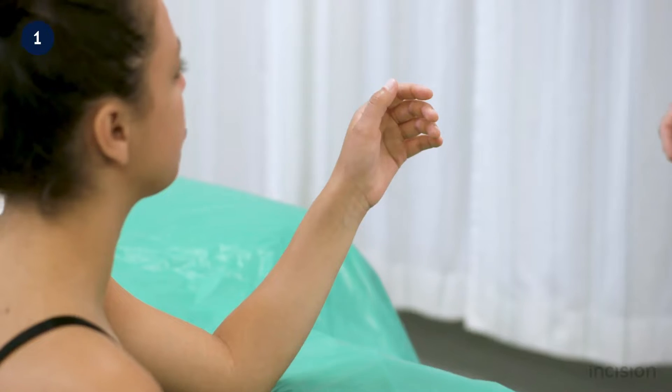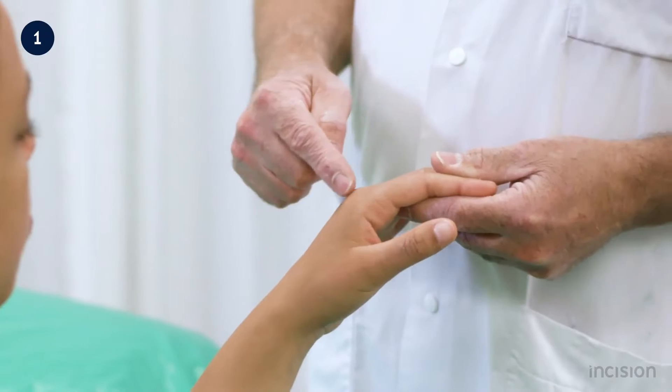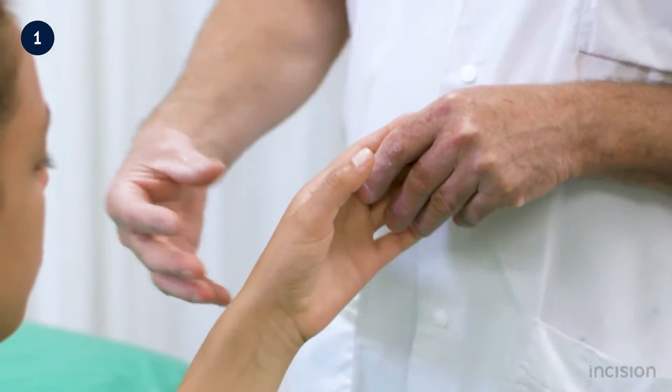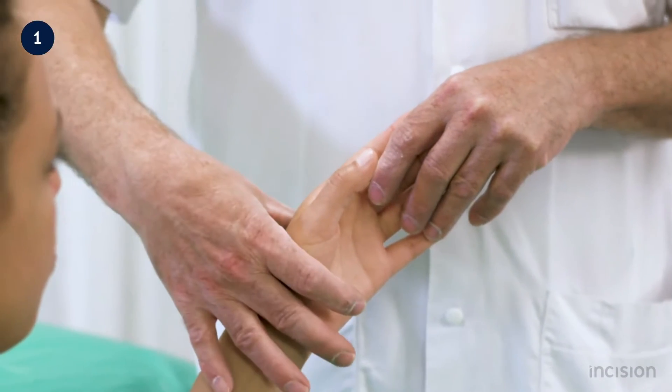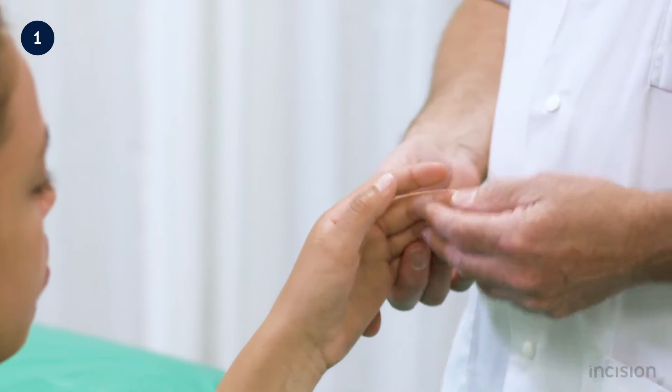In this film, the application of a radial gutter splint is demonstrated. These are used to treat second and third metacarpal fractures that are non-displaced, using a splint applied on the radial side of the arm.